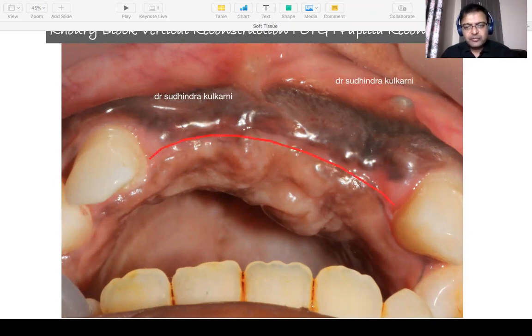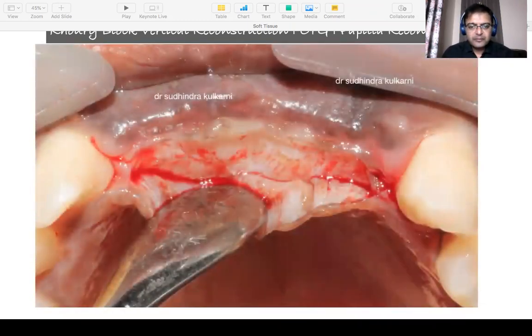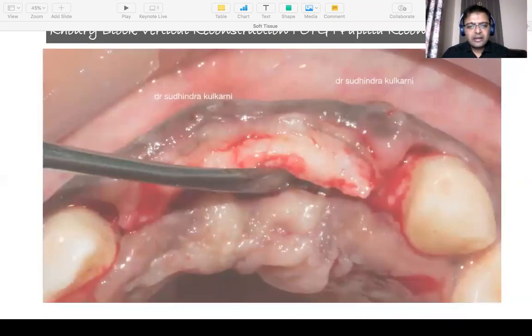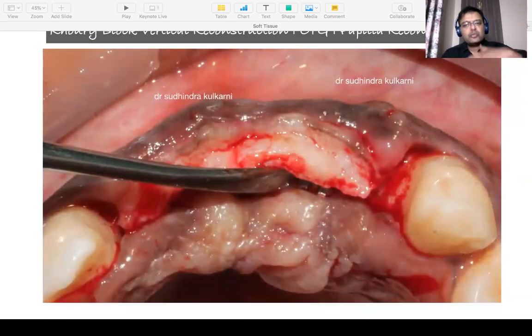At the time of implant placement, we designed the incision in 2 ways. We had a good amount of soft tissue bulk, so we made an incision there in the gutter. And this incision was divided into 2. One would give access and open up the site, and then I would move the palatal connective tissue onto the buccal side. So the second incision was done there. We separated out the epithelium and some connective tissue, and then used the remaining connective tissue to take onto the buccal flap. So we actually took the palatal connective tissue onto the buccal.